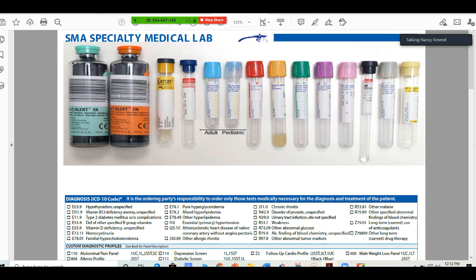Here you have blood cultures. You'll notice that this is kind of a lime green and this is orange. You may see these in a brilliant blue and maybe a lavender, in which case we always have aerobic followed by anaerobic. Because of these vials — you can see the size of these — they're huge. You have to use special adapter tubing or adapter vacutainer holders.